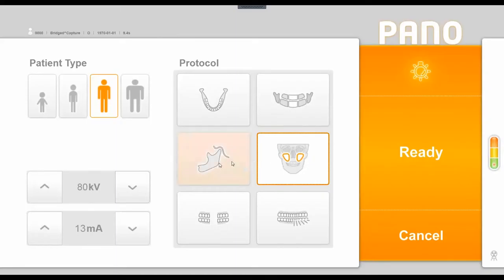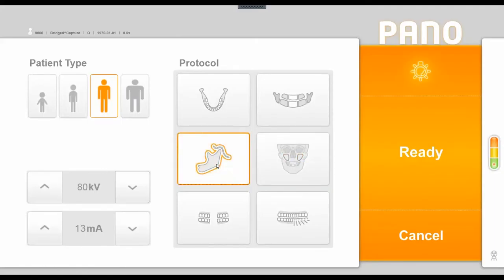To the left is a two-dimensional TMJ acquisition option, and what this would let you do is take one rotation around the patient or two rotations around the patient. If you chose to do two rotations, it would actually put your patient's right joint open and close next to each other, and their left joint open and close next to each other.